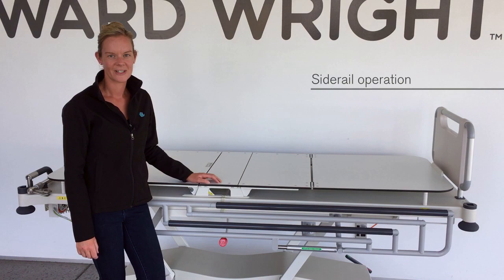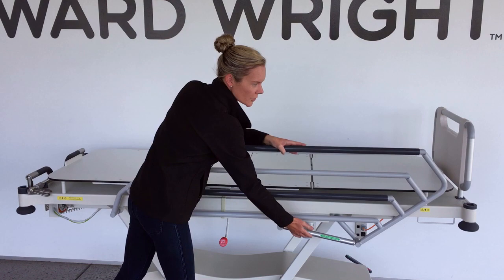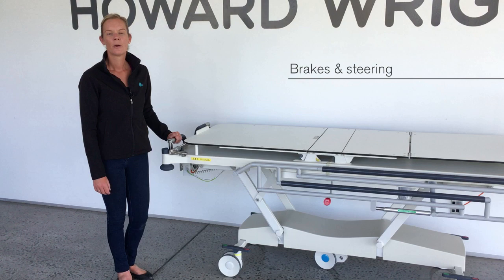Side rails are fitted to either side of the stretcher. To raise, simply lift the top rail. To lower, lift the release lever and push the top rail towards the foot end.